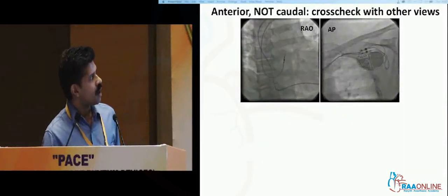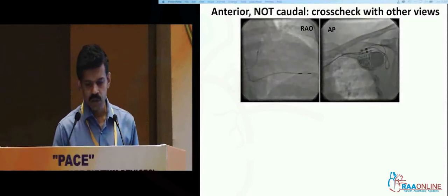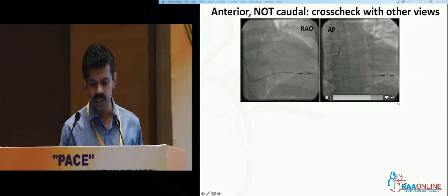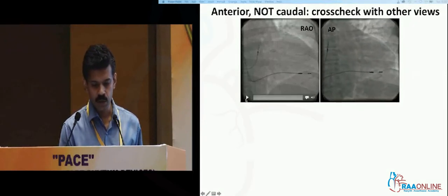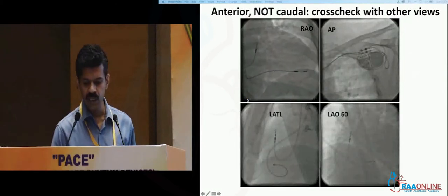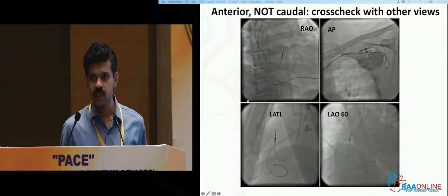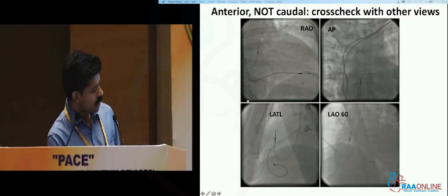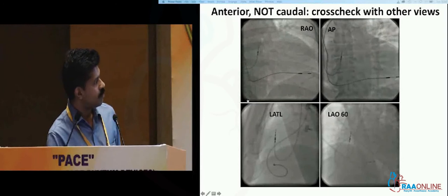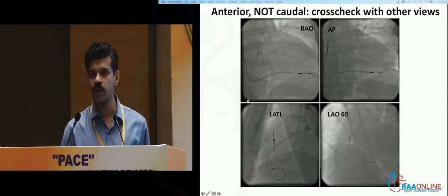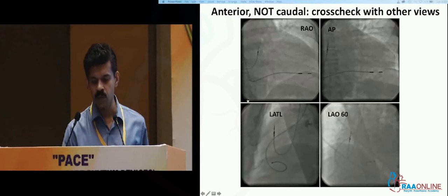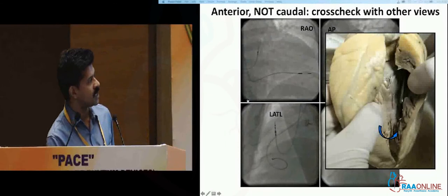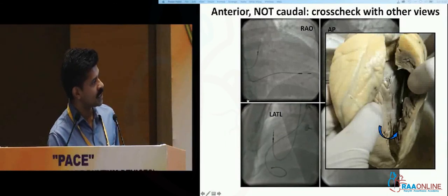Whenever a lead is anterior but not caudal, please cross-check with other views. This is a lead that was left anterior, but you can see it has not gone caudal. This is the AP view and this is the right anterior oblique view, but once we get to the other views, you see it is nowhere near the apex. So if you get a lead that has gone anterior but not going caudal — not going down and crossing under the diaphragm — please make sure you check the other views. This lead is absolutely nowhere near the apex; it's far worse than what the RAO and the AP view suggest. It was going down towards the apex somewhere, but it ended up misplaced.